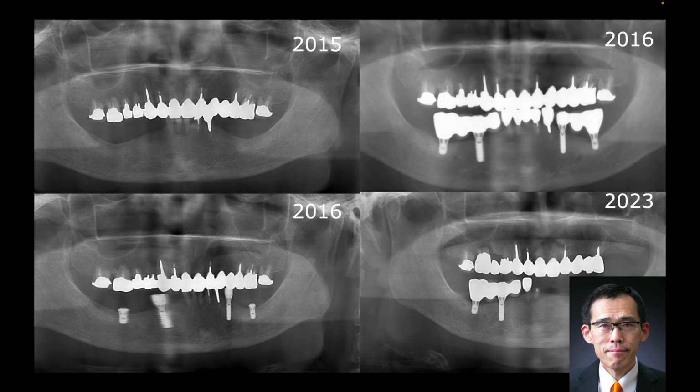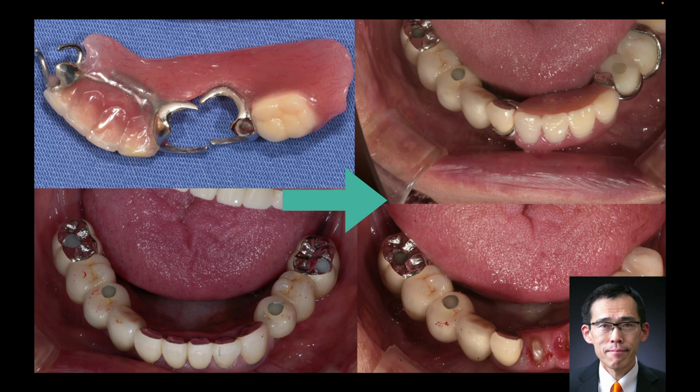Next case. 4 implants were placed in the posterior mandible for a fixed prosthesis in 2016. Unfortunately, teeth and implants numbers 36, 33, 32, 31, 41 were lost in 2021. She desired a fixed prosthesis. These are 6 years of change in her dentition.